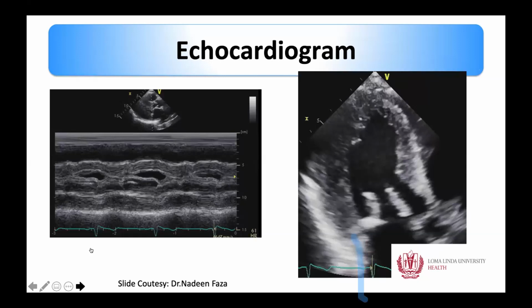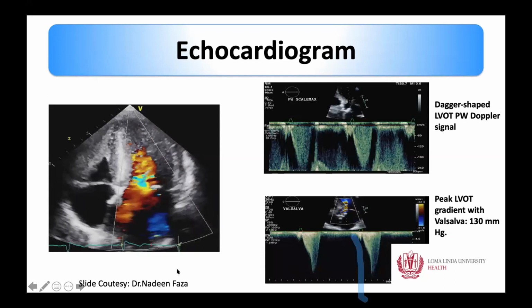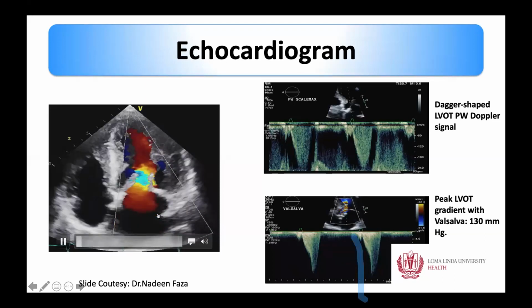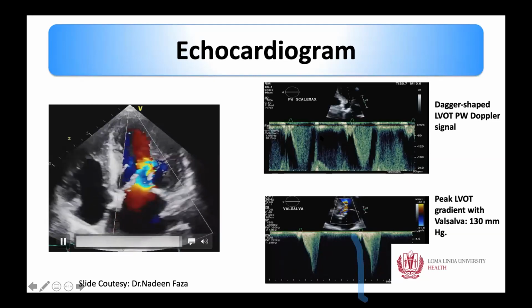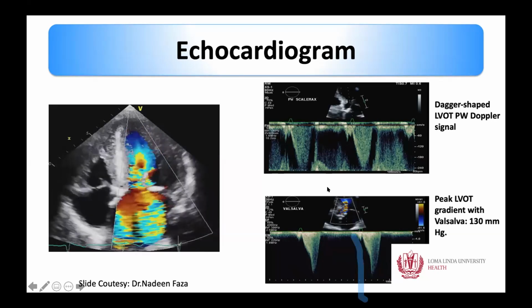So again, this is just another picture. There are two things that happen. Of course there is SAM, and because of that SAM, there is posteriorly directed mitral regurgitation, and then there is LVOT obstruction, which generates the gradient through the LVOT. This is typically a dagger-shaped gradient, which you can see on the pulse wave as well as the continuous wave Doppler.